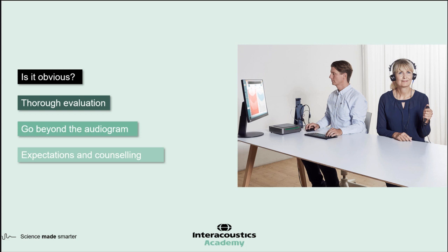Managing expectations and counseling is really, really key. I think with any audiology patient or client, but never more so than with somebody who's got added complexities and complications. I firmly believe that managing those expectations actually starts before you've even performed audiometry, and certainly before you've fitted a hearing aid. So there's a lot to think about before we really even get started.